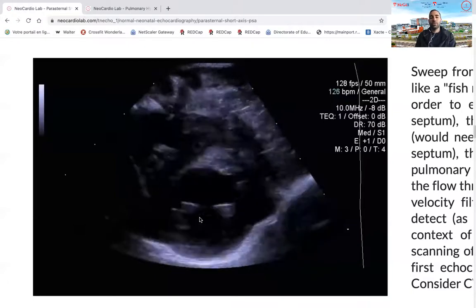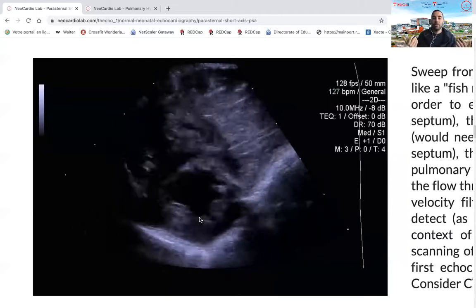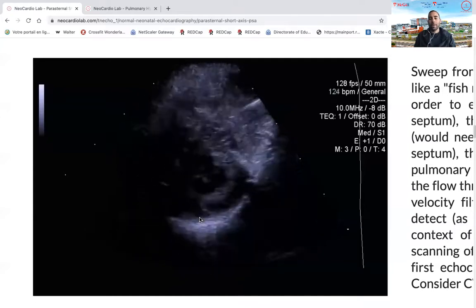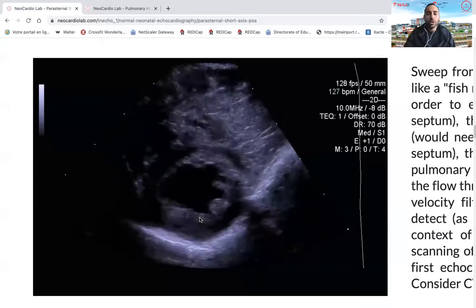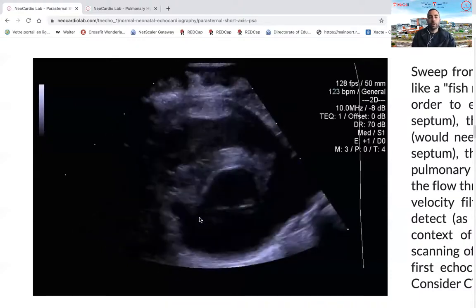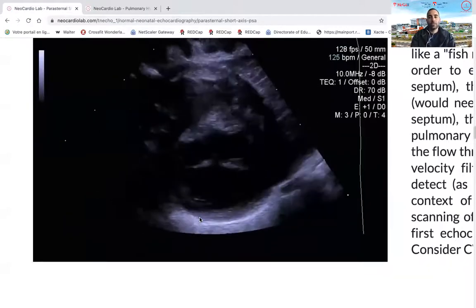If you don't have a smooth surface of your left ventricle, you start wondering if there's a pathological process, such as either that you're having an inversion of your ventricles, or that you're in a situation where you have non-compaction cardiomyopathy or other types of cardiomyopathies. So already a sweep is a good way to have a good sense of the relationship between the different segments of your heart, as well as the contractional properties of your entire left ventricle, the contraction and the filling.